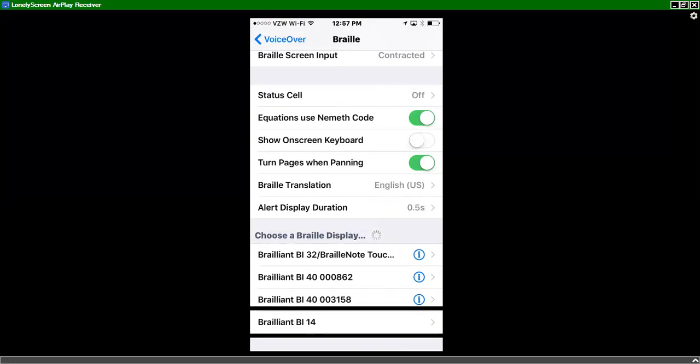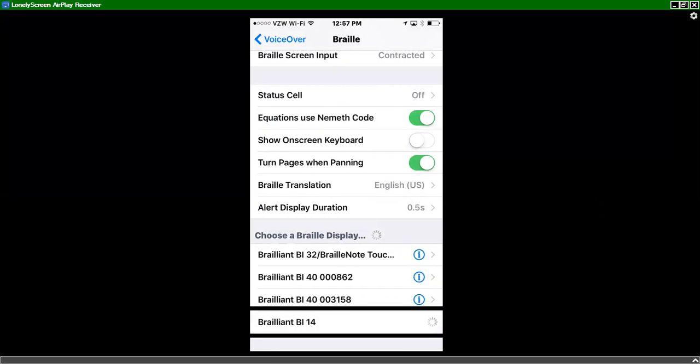Brailliant BI 14. All I'm going to do is double tap and you'll see that it pairs immediately. Brailliant BI 14. Pairing. I get a vibration on my Brailliant BI 14.